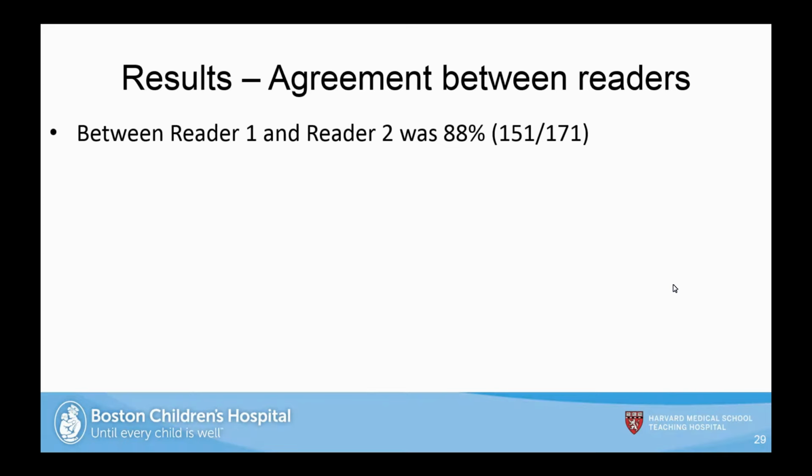Did you mention anything about transfer learning? Because the data set just seems a little bit small to generate an image from scratch. Yep. And actually, I learned a few weeks ago that you can train your algorithm with a small data set as long as you really know a lot about that data set. You have to know for sure whether, in this case, the images are non-diagnostic or diagnostic. They have to be really sure.